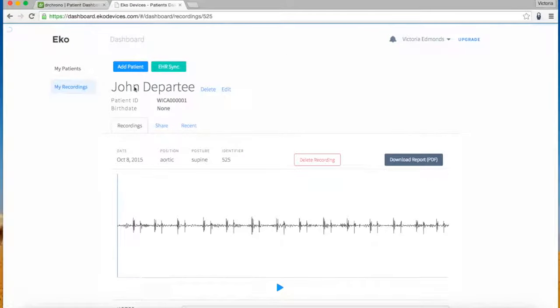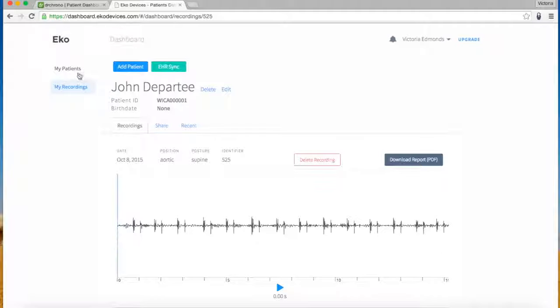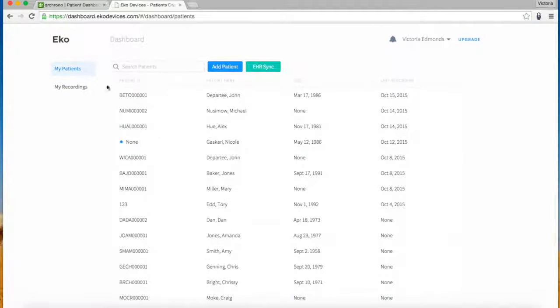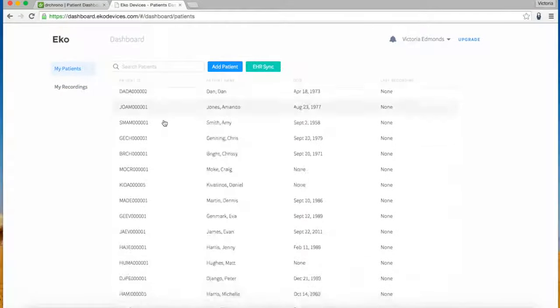The Eko web dashboard allows you to easily review all of your patients and recordings in one place.